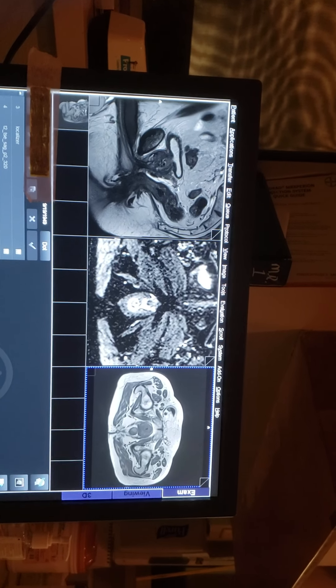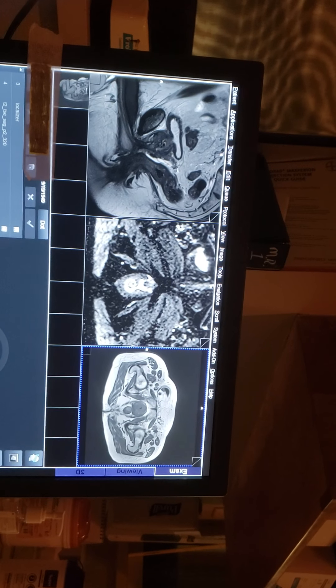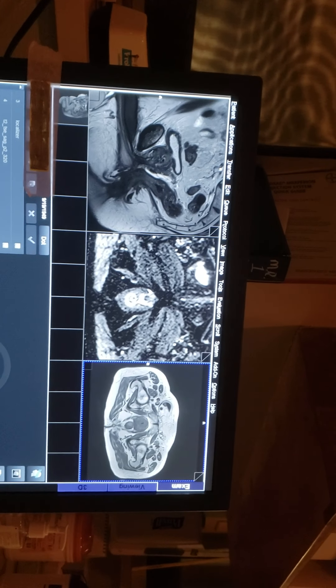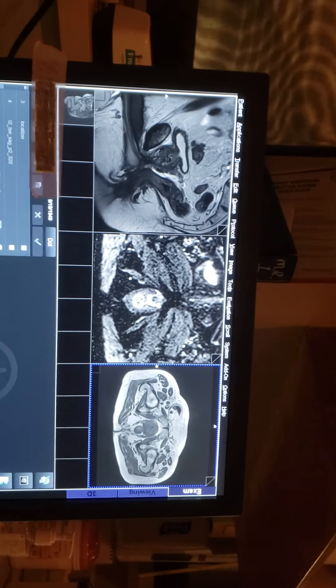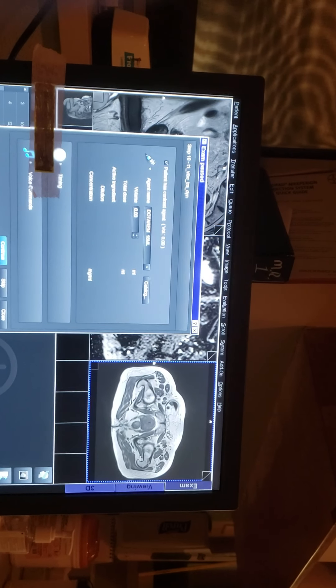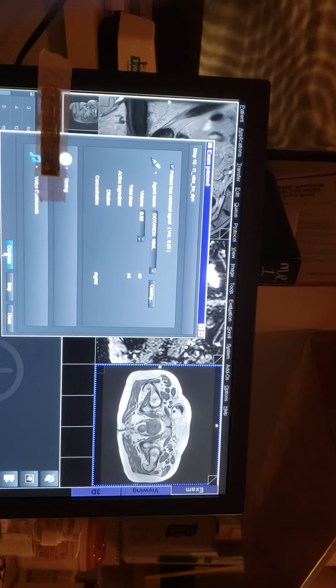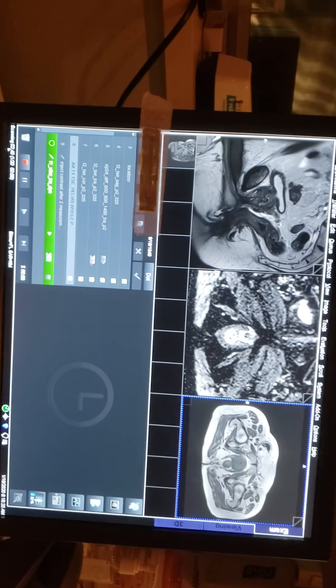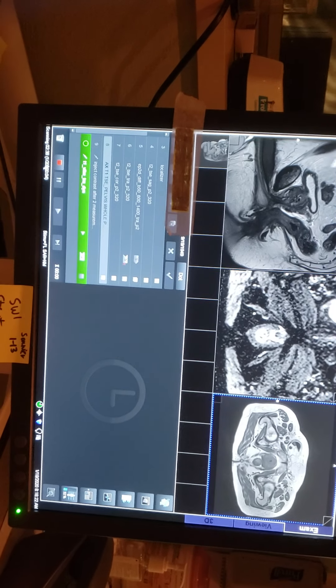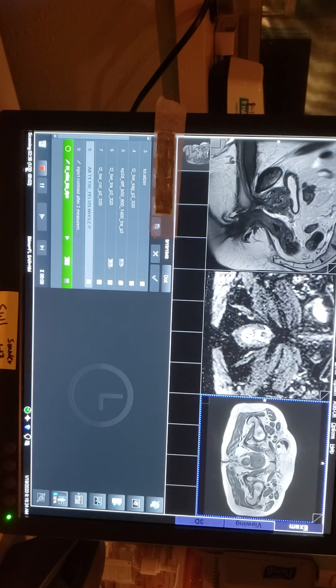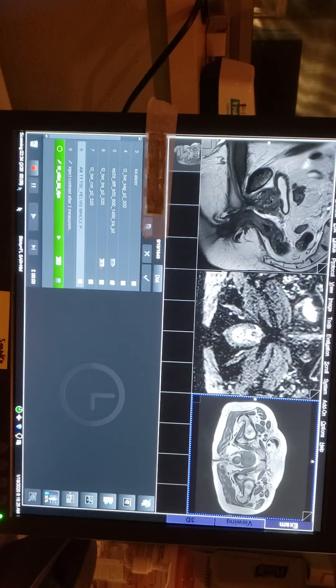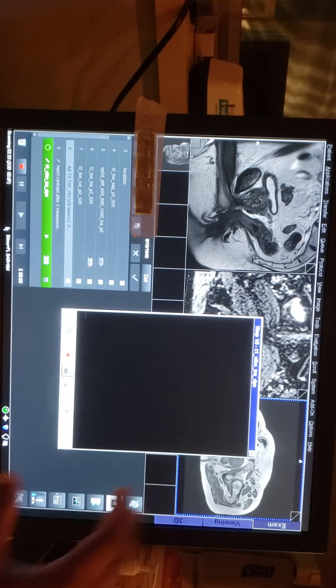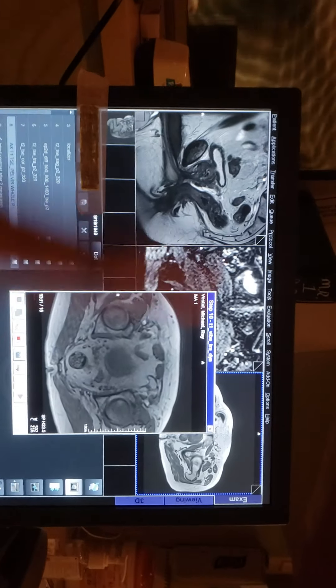Pretty much we're going to give the contrast after the second measure — so around pass number three, I'm going to go ahead and give the contrast. Everything is set up already. Now this is my contrast table here, already set up. If you look at the bottom of the screen you'll see the count — when it hits three, that's when I'm going to give the contrast.